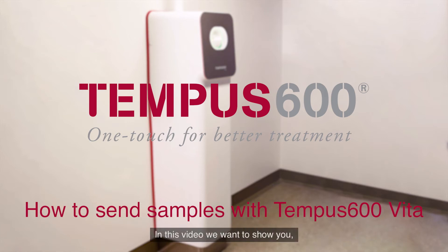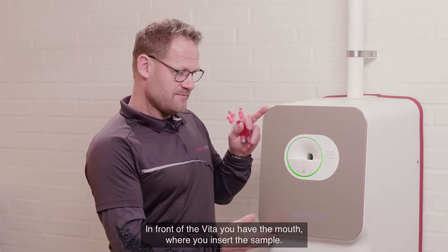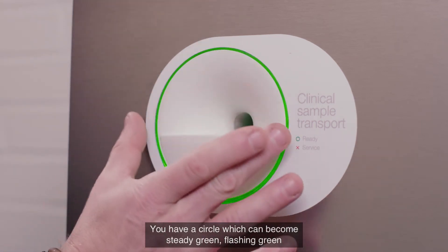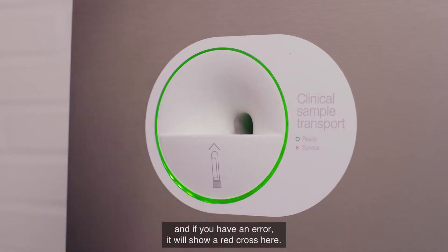In this video we want to show you how easy it is to send a sample with the Tempo 600 Vita. In front of the Vita you have the mouth where you insert the sample. You have a circle which can become steady green, flashing green, and if you have an error it will come up with a red cross.